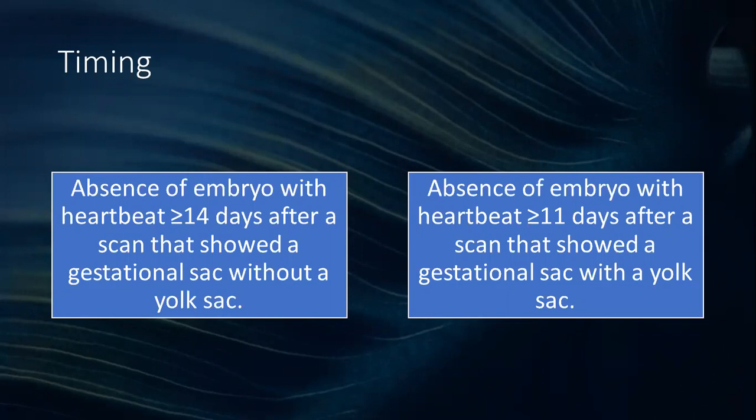So this is what is going to help you in scheduling your follow-up. You are going to look at whether you are seeing a yolk sac or just a gestational sac. So after approximately how many days am I expecting to see my embryo? Then you set up the date for the scan approximately around those days or even a bit later to give the pregnancy a fighting chance.